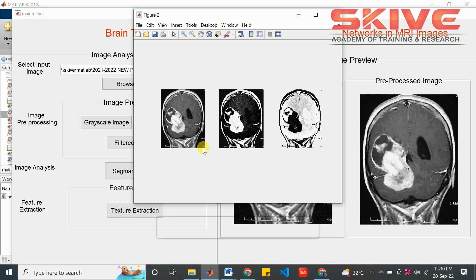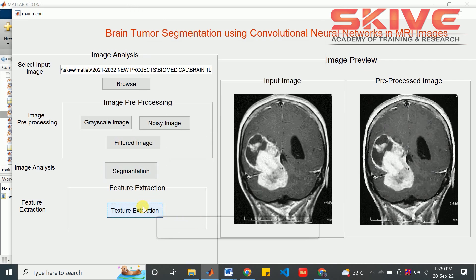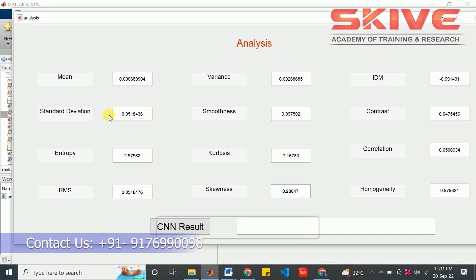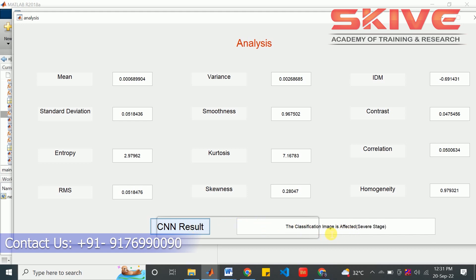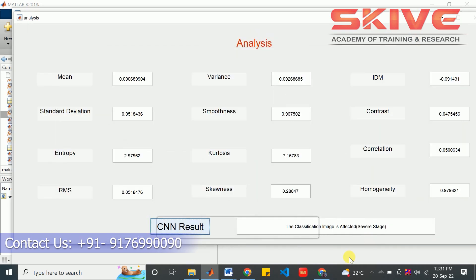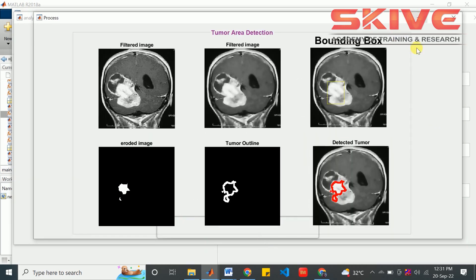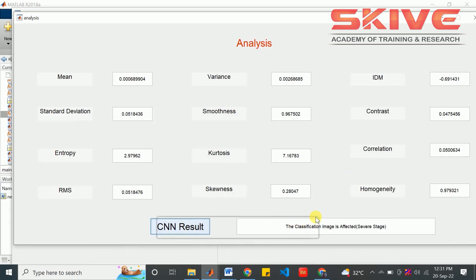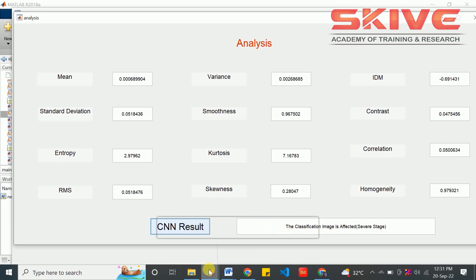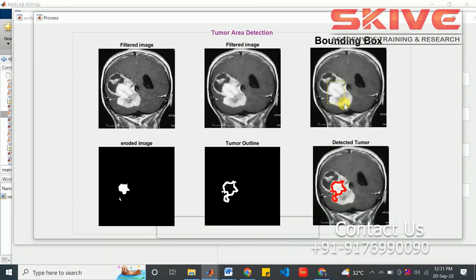The segmentation will involve the white matter and grey matter segmentation process. These are the parameter results from the texture extraction process. Now we have to see the classification result. The classification image is affected. After the result process, we get the segmentation of the tumor area, the filtered image, and the bounding box of the affected region.